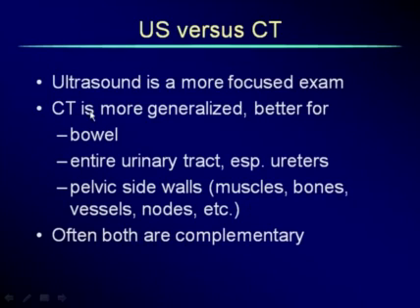Now, we all know that ultrasound is an excellent modality for evaluating the female pelvis. But what we're actually doing is focusing on pelvic organs, so it's more of a focused examination. CT has a broader scope of the structures that we can look at. It is used for more generalized types of evaluations.